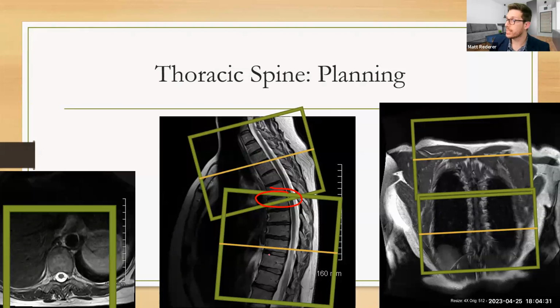I'm constantly getting something. And if here is my canal, I want to be as perpendicular. My slices have to be as perpendicular as possible to these blocks of slices. All right. And don't worry, you guys, next semester are going to go through all this again, this planning part of it all.